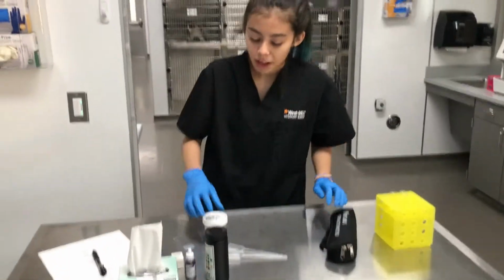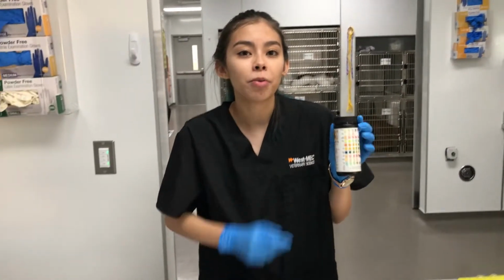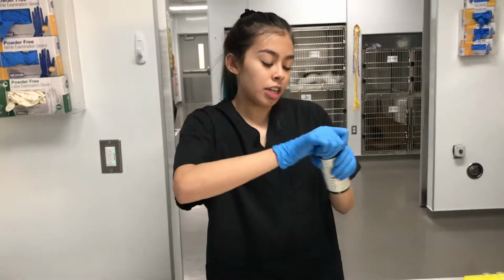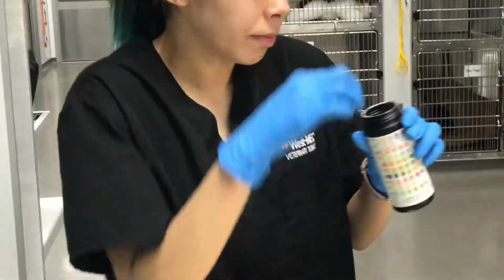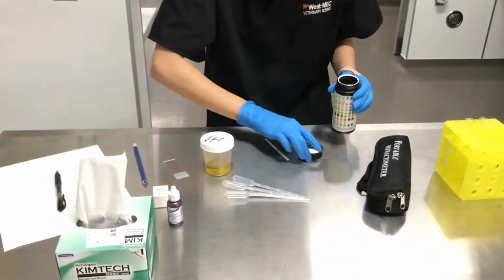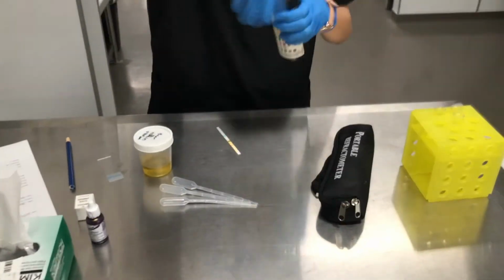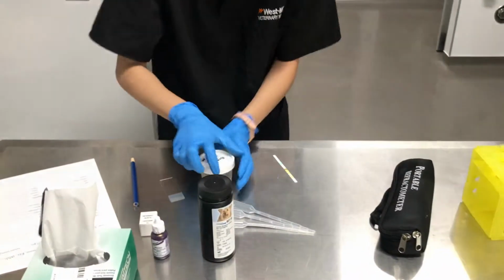So the next step is using chemical assay strips. I will place a drop of pee onto each square and then follow the directions on this bottle. So I'll close this off so all the rest of the strips stay fresh.